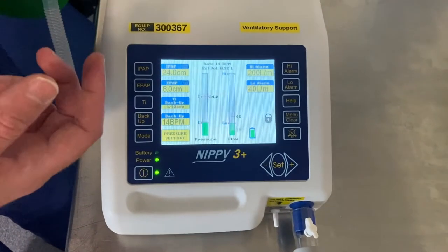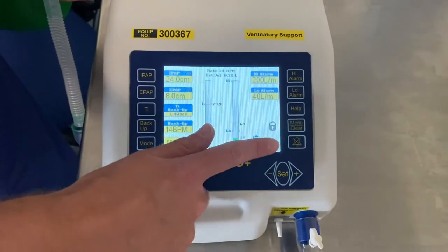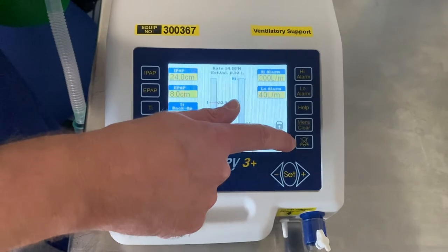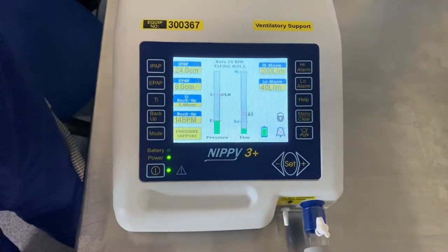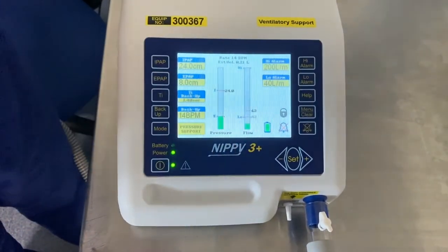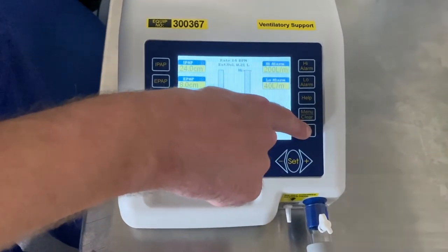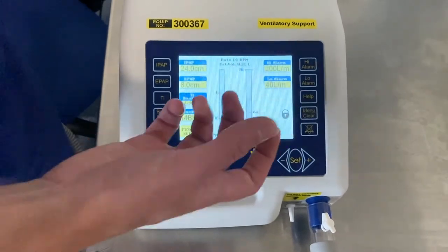If an alarm sounds on the ventilator, we can silence it for two minutes by pressing the button which has the bell with the cross through it. Once you've resolved the issue, it's really important to take that alarm silence off — do this by pressing and holding that same button down until you hear the second long beep. You'll see the bell with the cross through it disappear from the screen.